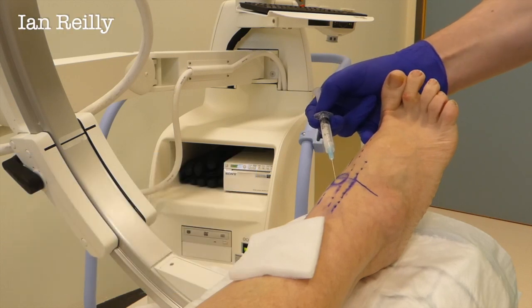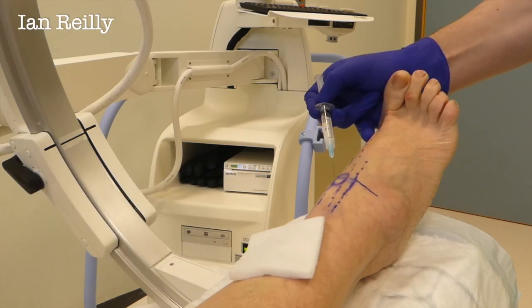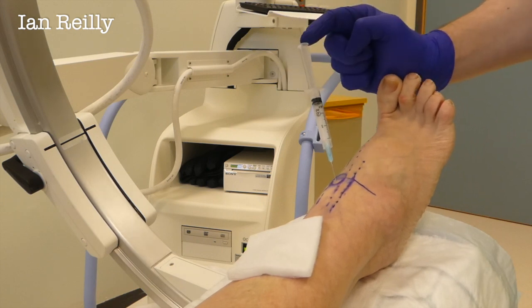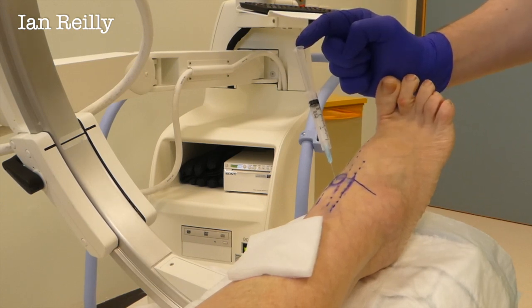I'm going to come again — and we're on the money there. So a little scratch coming — three, two, one. Can you see on the screen where that needle is? Can you see where that tip of that needle is on the screen?